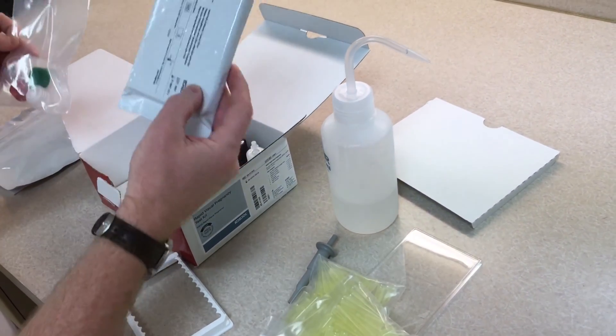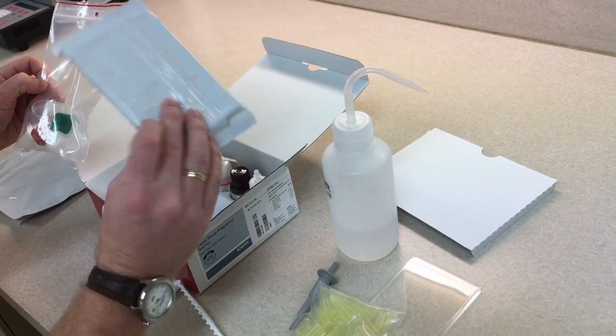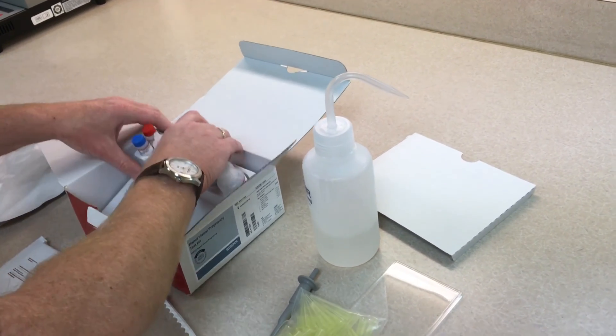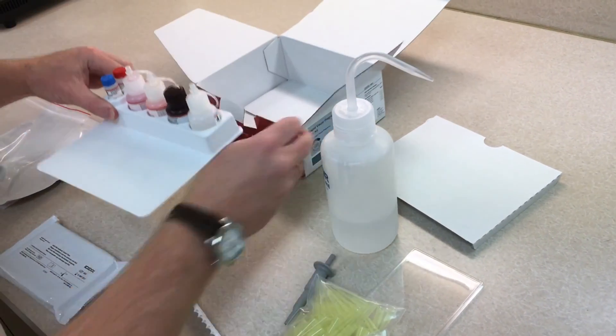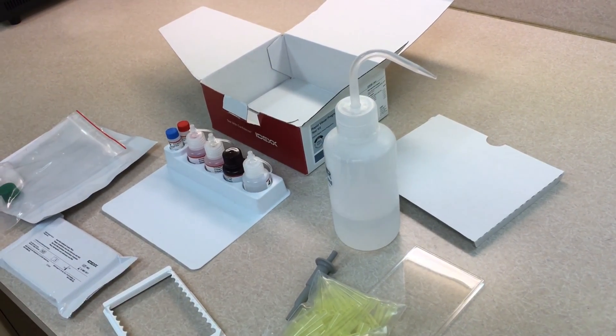You'll also get these plates — two of the 96-well plates for a total of 192 wells — and then of course all your reagents that you will be using throughout your test sequence as well.